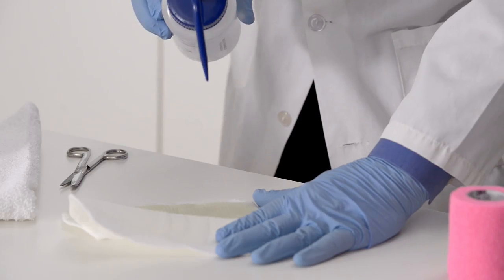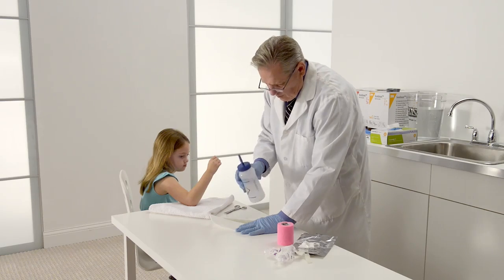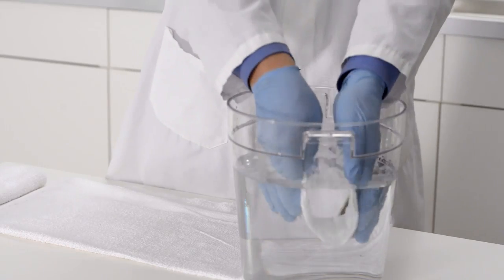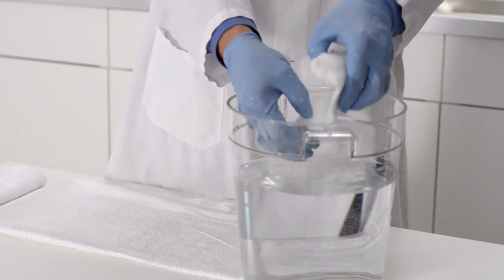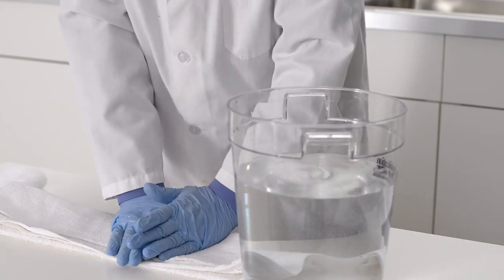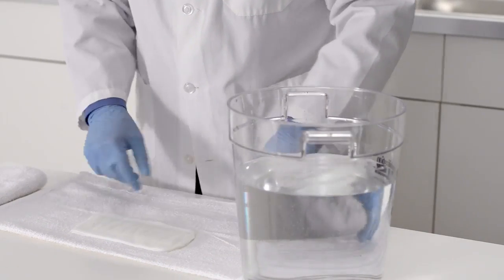The amount of time between activation of the splint material and set time can be customized based on the amount and temperature of the water applied to the material. Or another option, to wet the splint, immerse it in a bucket of water and blot off excess water in a towel. Using water that's room temperature provides approximately 3 minutes of molding time. To extend the working time, use cooler water.